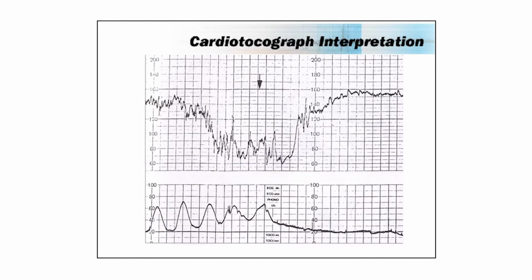What happened? If you note the contractions here stopped immediately. Okay. So if you stop syntocinon, it won't stop that fast, will it? It won't just absolutely stop. Now someone said to me, and I thought it was a very good point, someone said, rupture, which is a very good diagnosis because that could be a severe rupture, but it wasn't, thankfully.